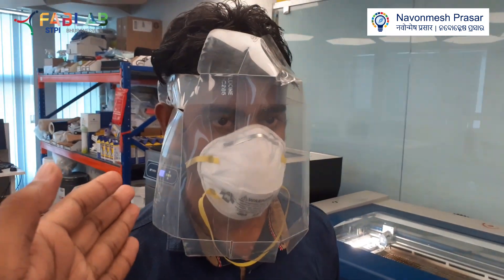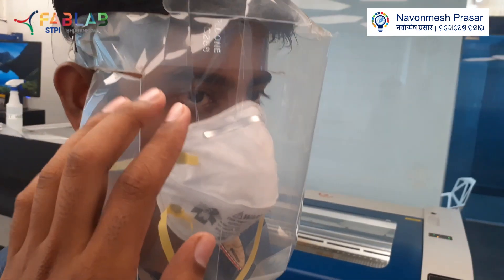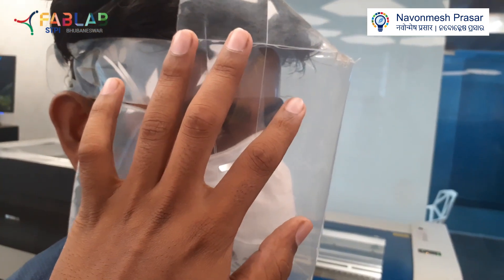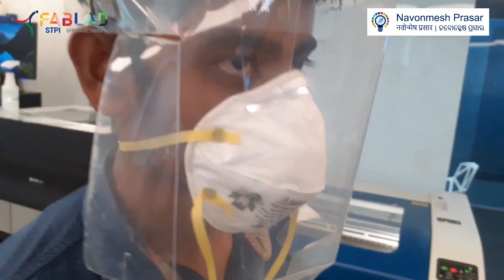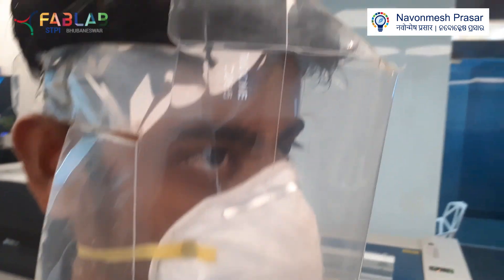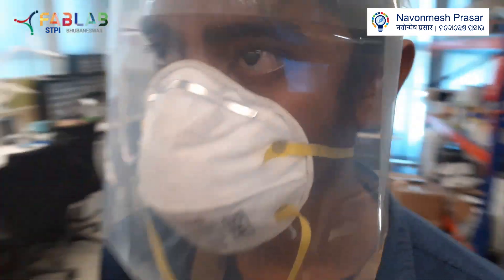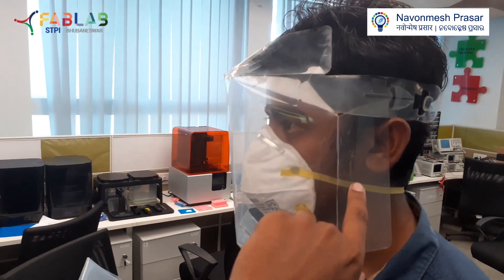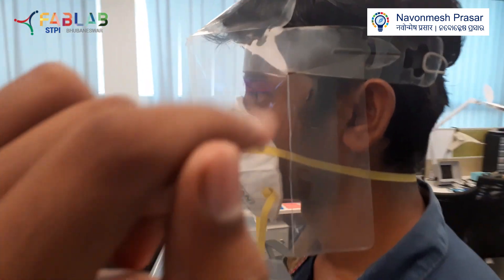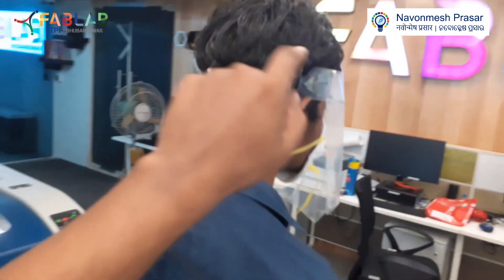This is the face shield we are talking about, and you can see that there is a lot of space between this face shield and the face. You can easily wear a face mask inside, and there is protection from this side as well, and extra protection from this side. You can see how it is tied — it is tied easily with the help of a string over here.